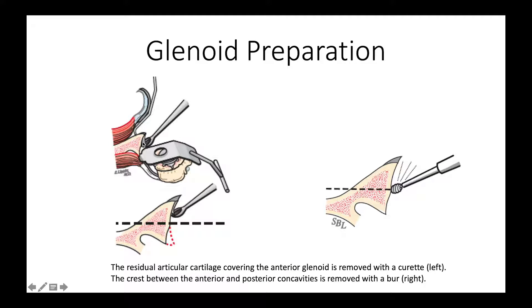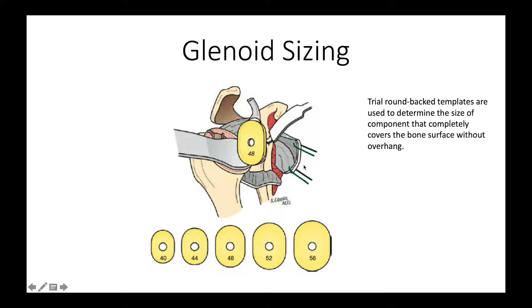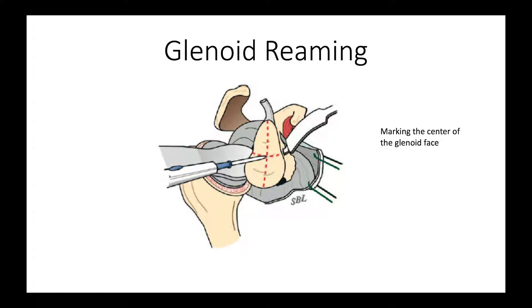The first step is to curet away the remaining cartilage so that we just have a nice bone surface. Then we take a pinecone burr and remove the crest between the anterior and the posterior concavities. Almost all osteoarthritic glenoids have this biconcavity, and the goal of reaming is to get rid of the biconcavity and convert it into a nice single concavity. We also size the glenoid using sizing discs just to see about how big the patient's glenoid is so we can match that with our component.